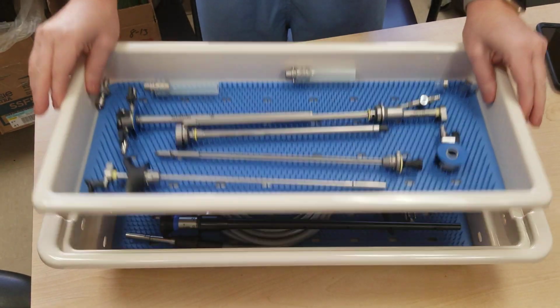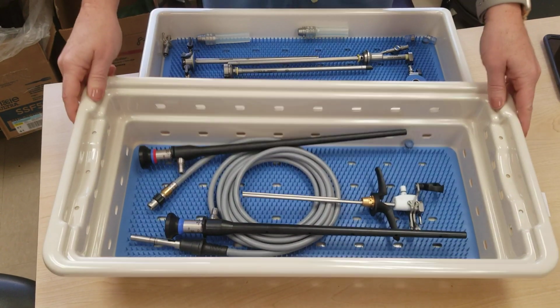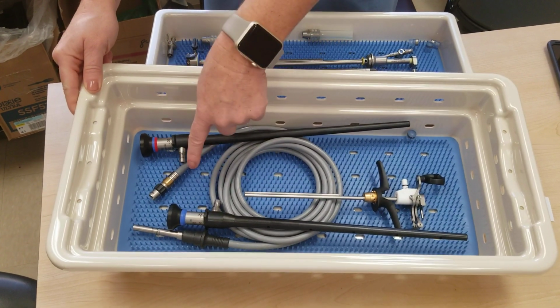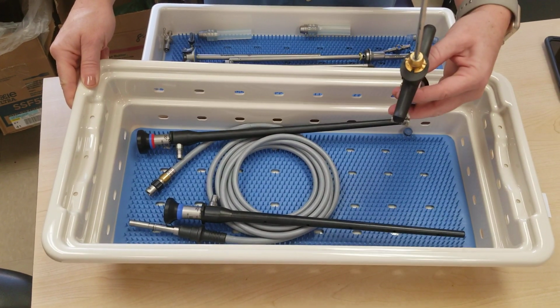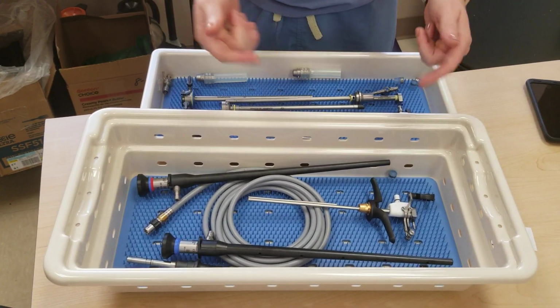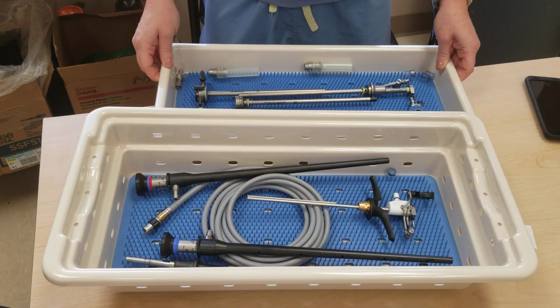So this is the new Olympus resection set. In the bottom tray, you've got a 12 and a 30-degree lens, light cord, no adapter needed, and then one working element. It's all bipolar, so always hang saline, and that's your one working element. And then in the top, here is everything else.